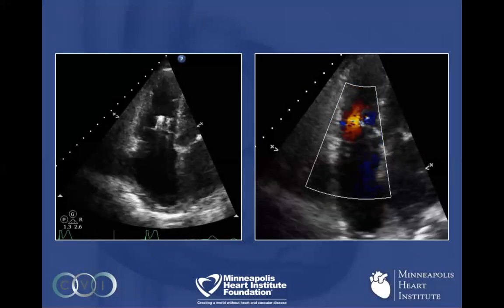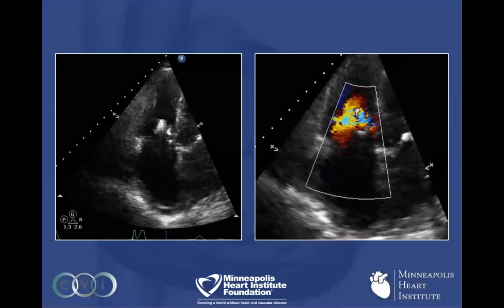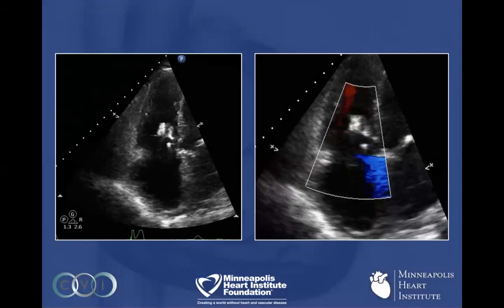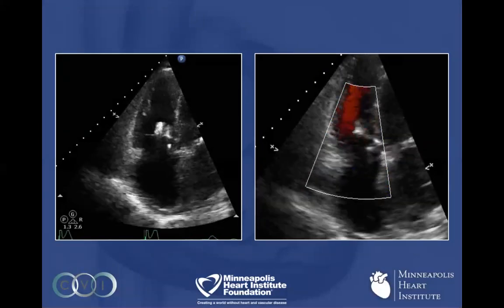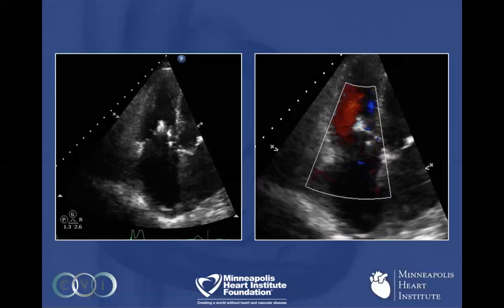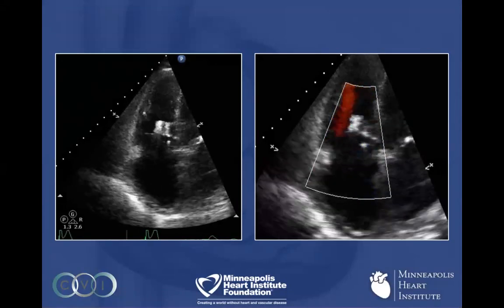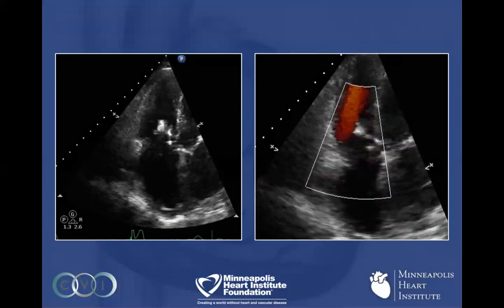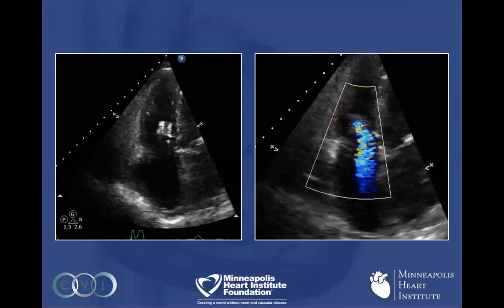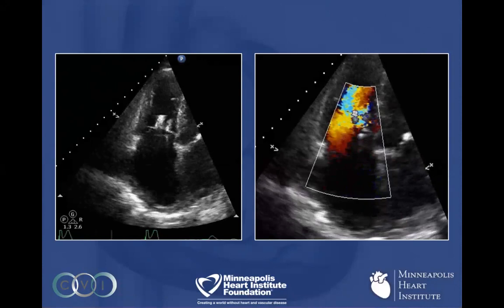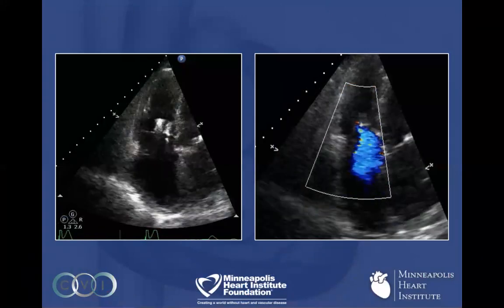Here's the transthoracic echo taken postoperatively. You can see the TR, which was completely torrential, is now mild to moderate. And you can see the two clips intact.